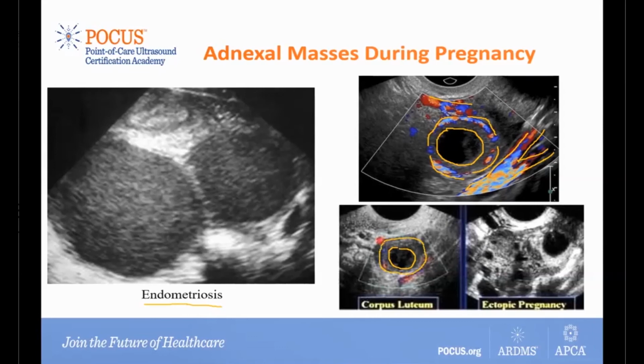See how it is hypoechoic as compared to an ectopic. You see this is an ectopic pregnancy, and I'm drawing in the lower extreme right. We see a bagel sign, and we even see a small embryo inside over here. You may see cardiac activity if you zoom in, as well as a small yolk sac present.